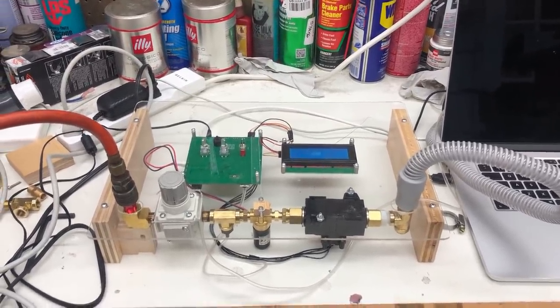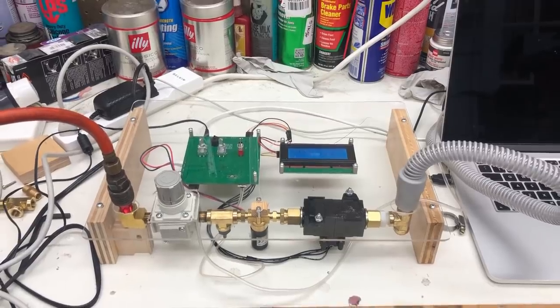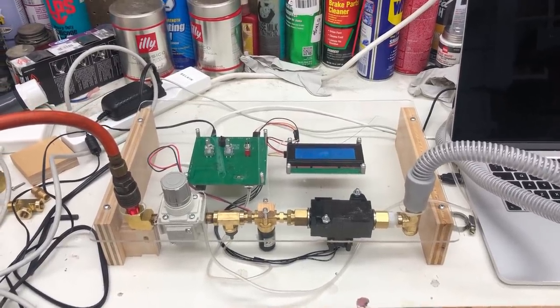Today I'm going to tell you about OpVent, our open-source proportional solenoid valve ventilator that you're looking at a prototype of here.